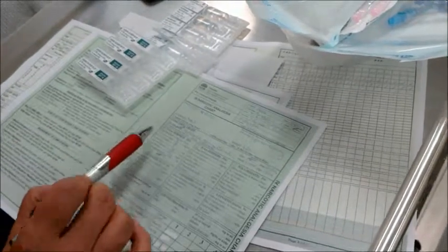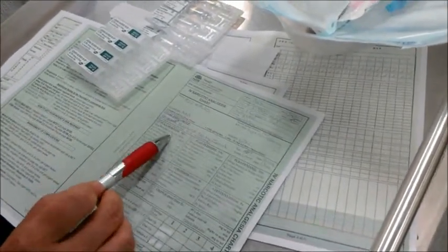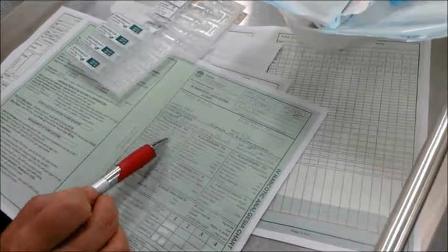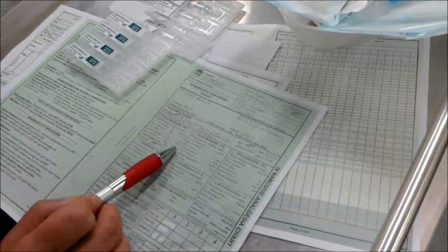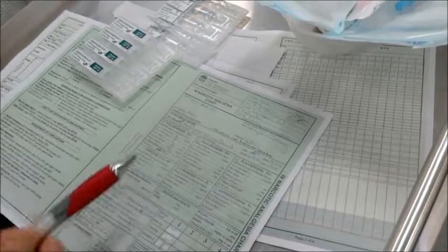Yeah. So let me read my medication out. Morphine 50 mg in normal saline in 50 ml. Concentration is 1 milligram. Number of syringes is 3. PCA dose is 1 milligram. Lockout interval is 5 minutes. Basal infusion is 0 and hourly dose is 12. It's been signed by doctors.